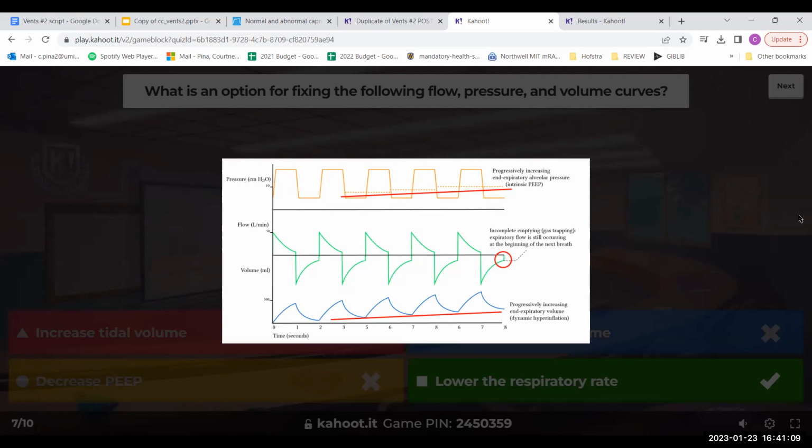So the concept is that adjusting the respiratory rate would indirectly affect your I time and E time, inspiratory and expiratory time. Whenever you go fast, you inevitably come at the expense of expiration, because physiologically, inspiration can happen much faster than expiration. And this is what even non-intubated humans do, right?